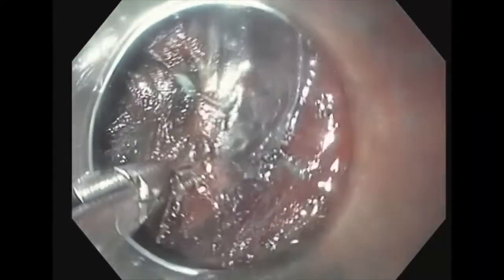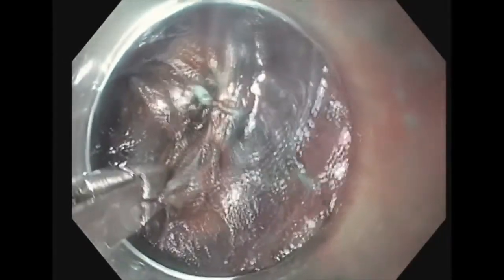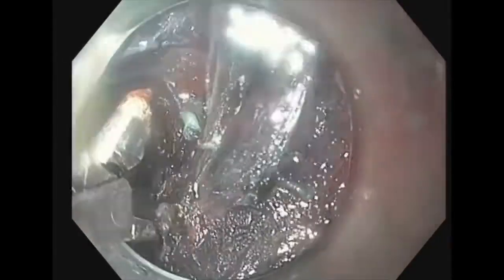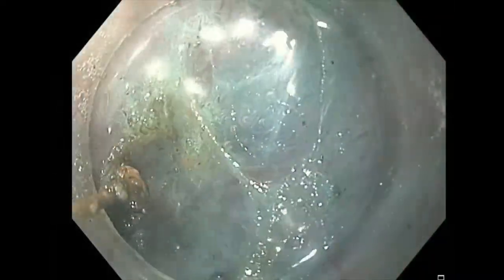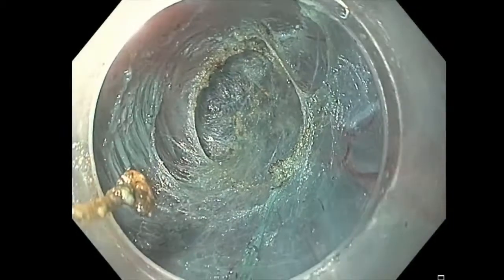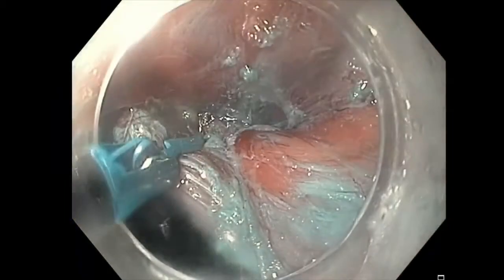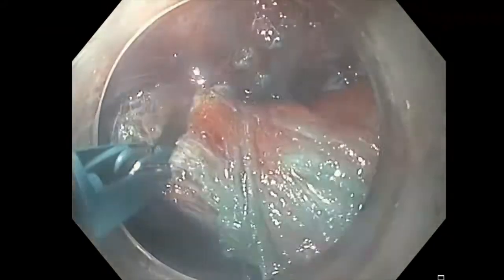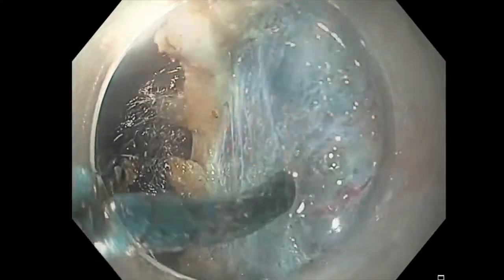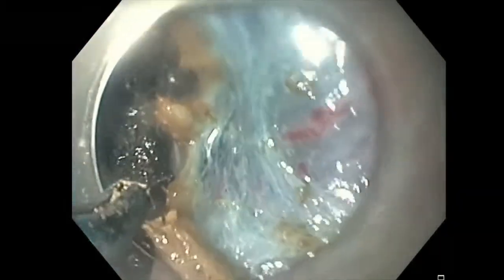Here, coag graspers are used to grab the culprit vessel, and a gentle pull towards the scope while applying soft coagulation successfully stops the bleed. Dissection is then continued until the septum is completely exposed on both sides. A complete myotomy is then performed, transecting through the cricopharyngeal muscle and extending a few centimeters into esophageal muscle. Relook demonstrates full thickness myotomy.